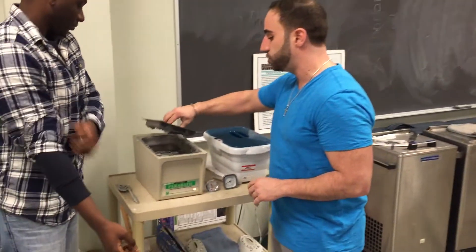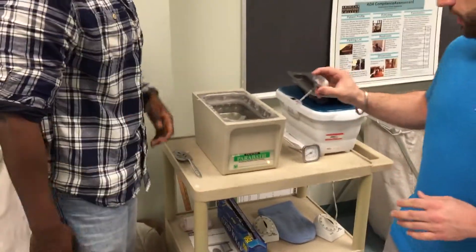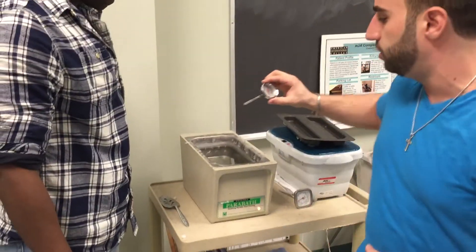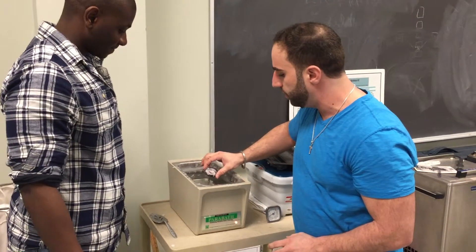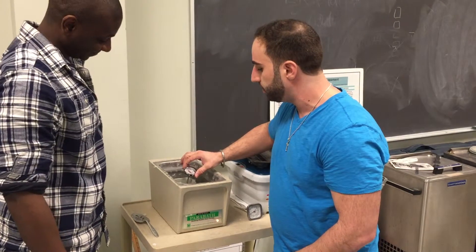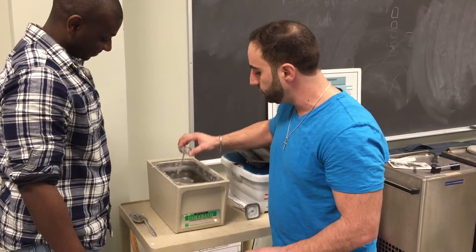The most important thing is to check the temperature of the hot wax. For therapy purposes, you want to make sure the temperature is between 126 and 135 degrees. After you see the solution has liquefied, stick a thermometer in for a couple of seconds — it should rise to about 129 degrees, which is perfect.